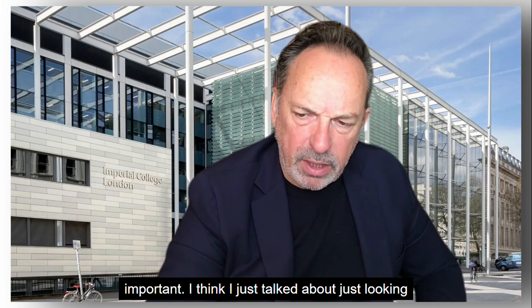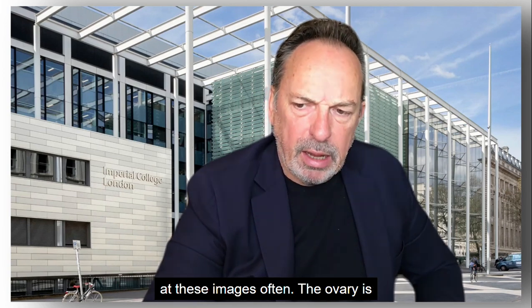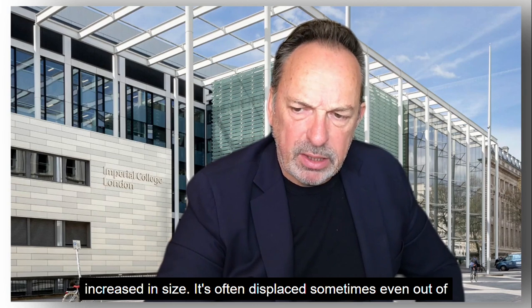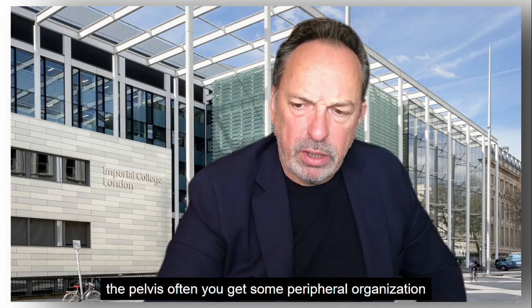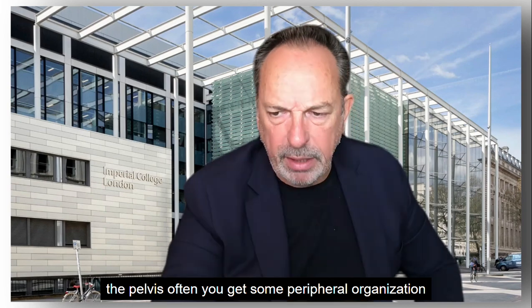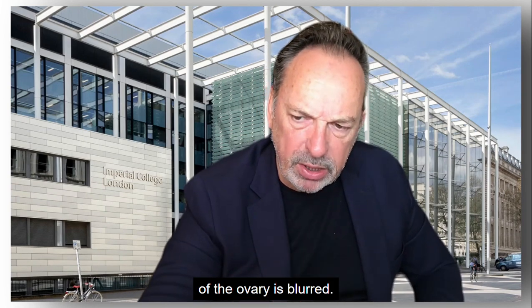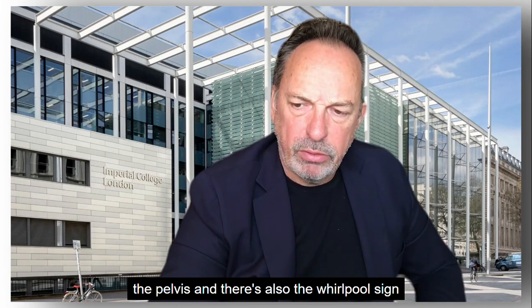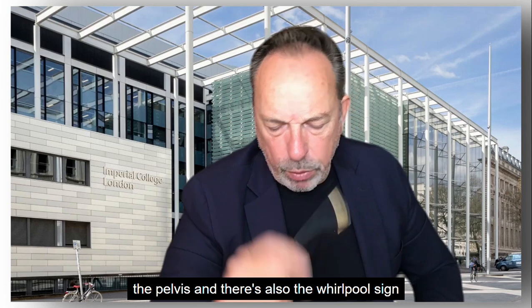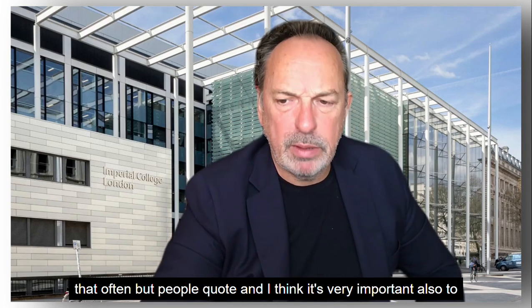The ovarian torsion, I think I just talked about, just looking at these images. Often the ovary is increased in size. It's often displaced, sometimes even out of the pelvis. Often you get somewhat peripheral organization of the follicles. The architecture of the ovary is blurred. You will often get a bit of free fluid in the pelvis, and there's also the whirlpool sign of vascularity people quote. I haven't seen that often, but people quote.